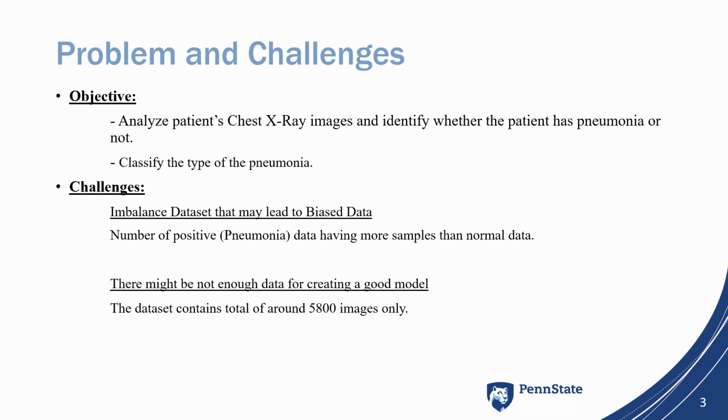Here are the objectives of our project. The first one is we want to analyze patients' chest X-ray images and identify whether the patient has pneumonia or not. And the second one, we want to classify the type of pneumonia, whether the pneumonia is caused by bacteria or viruses.